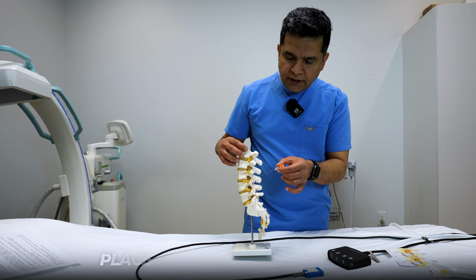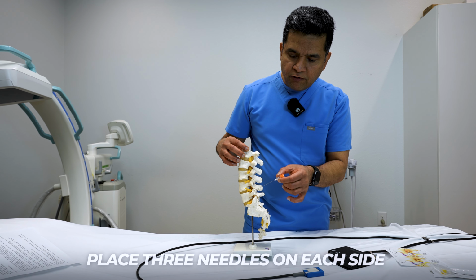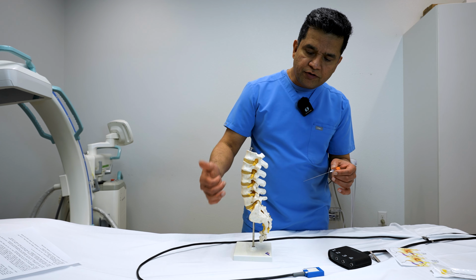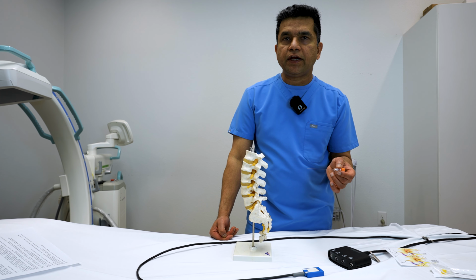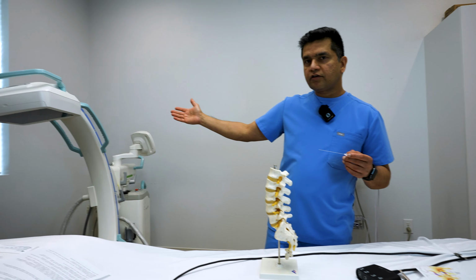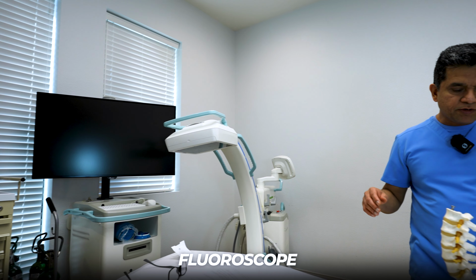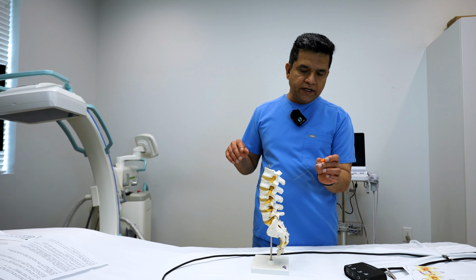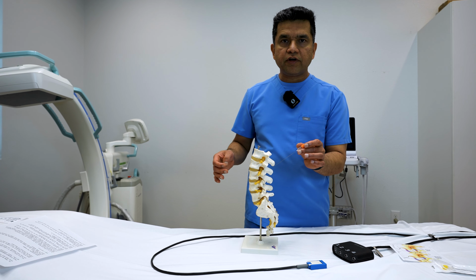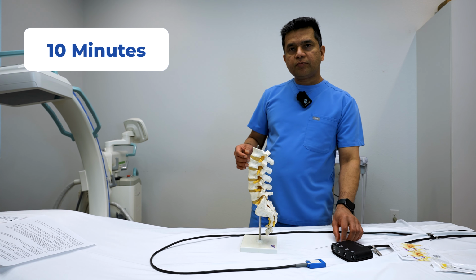And we place 3 needles on each side, and we deliver a small amount of numbing medication. And essentially we numb up 2 joints and see if that takes away the pain. And when we do the medial branch block, we use X-ray machine. You can see to the right, we use a fluoroscope, and that helps us to accurately place the needle to the correct location without any injury to the spinal cord or the nerve root. And it takes about 10 minutes. It's a pretty simple procedure.